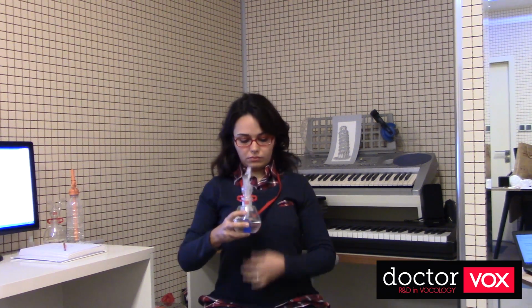So let's go bubbling without phonation. Bubbling rate is a good indicator of transglottic airflow. So the patient can use it as a feedback tool and control the glottic resistance more easily. So first, hold the bottle close to your rib cage. Now, place the tube into your mouth between the incisor teeth and 1 centimeter of it above the tongue.